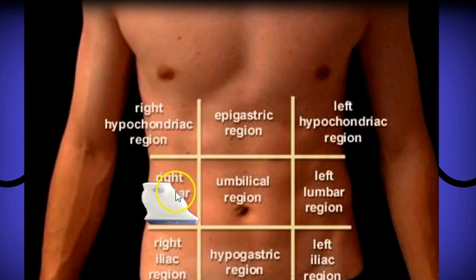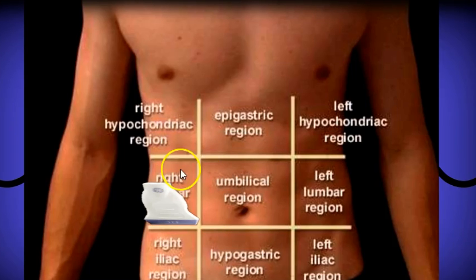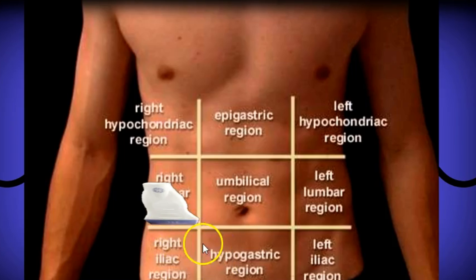In the right lumbar region, the lower pole of the right kidney is visible. You'll find a lot of intussusceptions in this area — sometimes a little lower. Once you finish the right upper quadrant, you want to do some guided compression along the ascending colon down to the right iliac fossa, where you typically find the appendix.